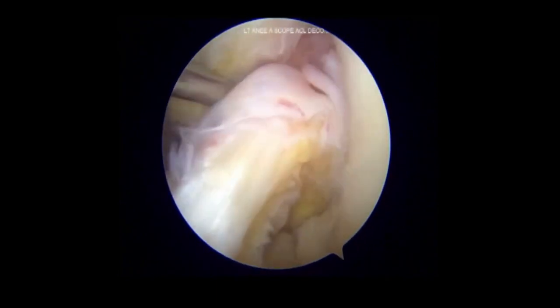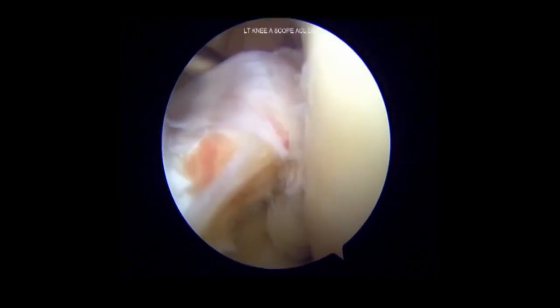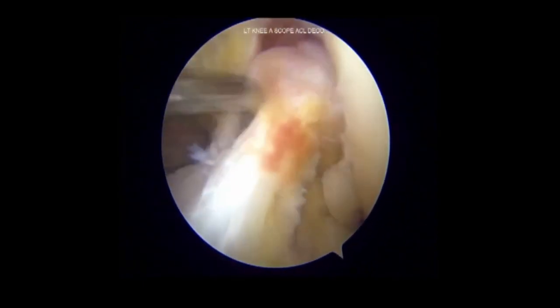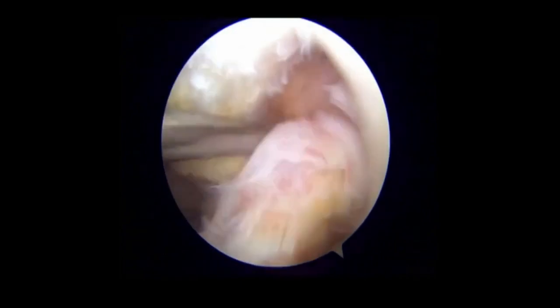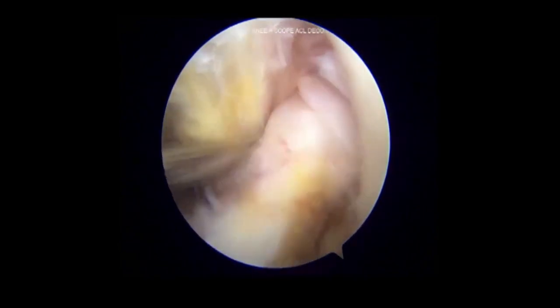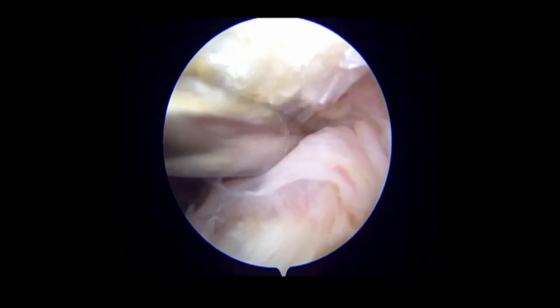The scope is switched back to the anterolateral port to address the ganglion in the anteromedial bundle. The cyst fluid is seen extruding at this point in time. Now a window is created between the ACL and PCL to enter the posteromedial compartment after shaving off the septum.